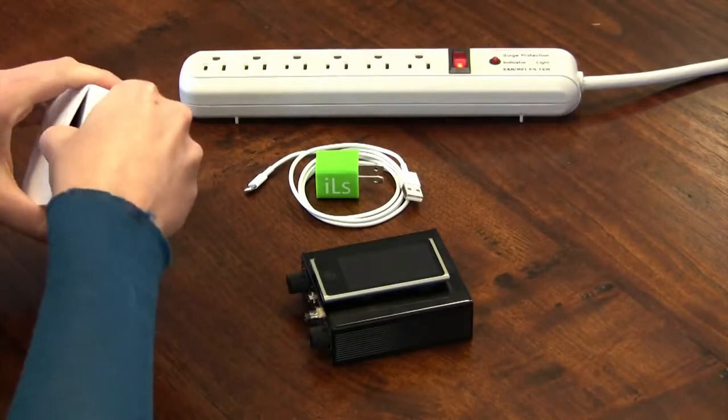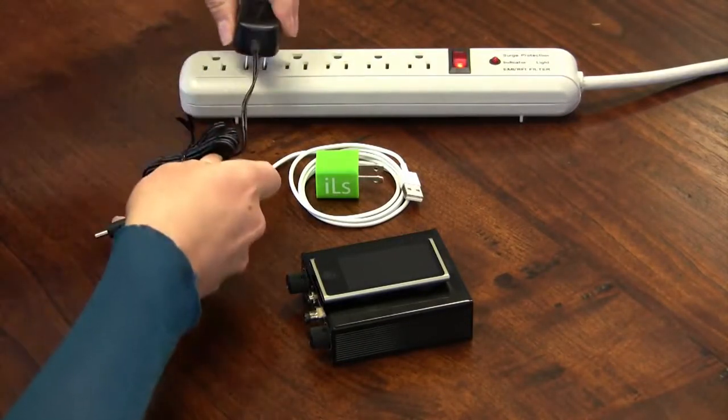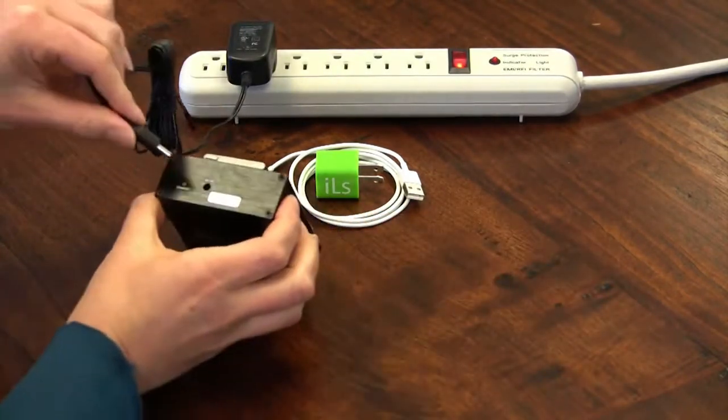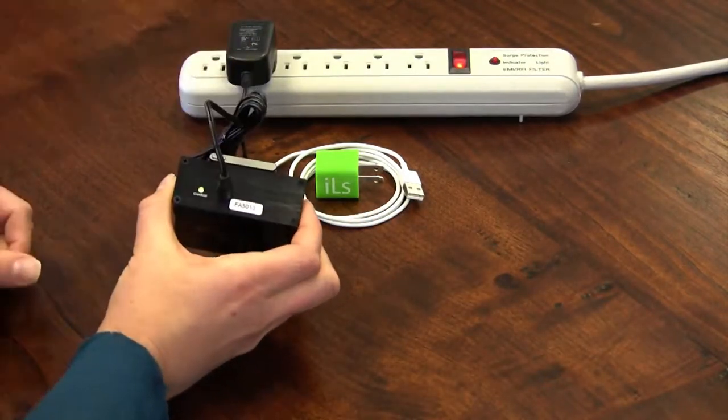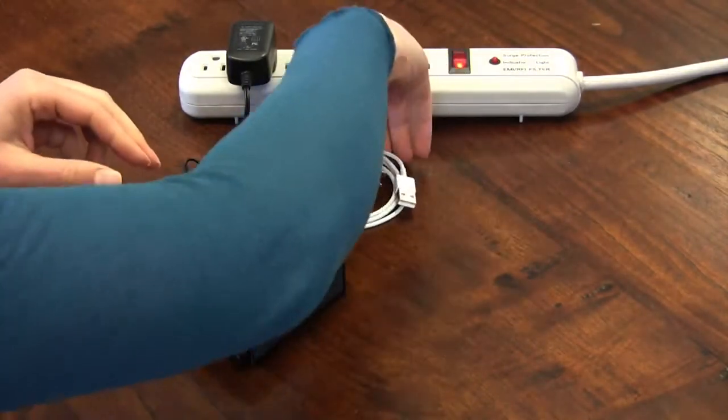Before using your system, you should fully charge it. Plug the black amp charger into a surge protector, and then plug it into the power jack labeled 5V DC on the back of the amp. A green light will come on to show that it is charging. When the amp is fully charged, the green light will turn off.